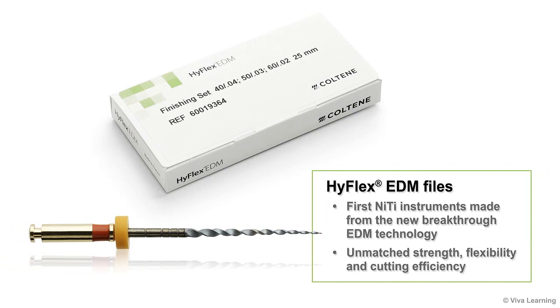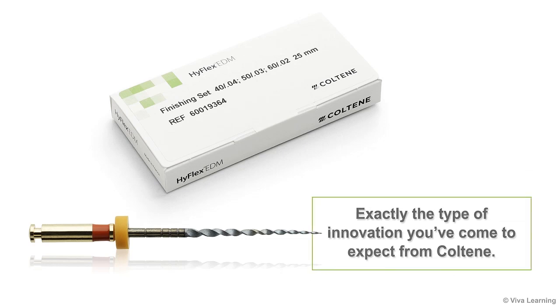In summary, HiFlex EDM files are the first NiTi instruments made from the new breakthrough EDM technology. HiFlex EDM files give you unmatched strength, flexibility, and cutting efficiency for the preparation of even the most complex canals — exactly the type of innovation you've come to expect from Coltine.